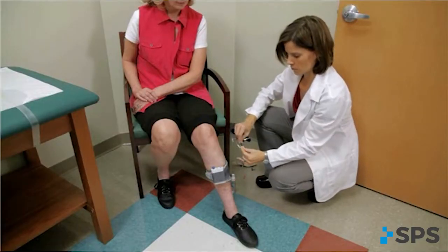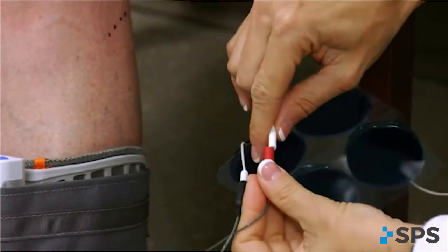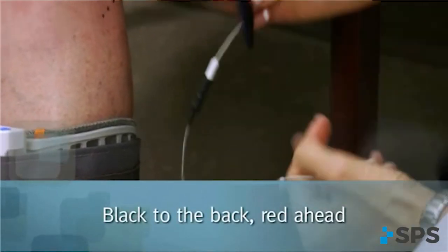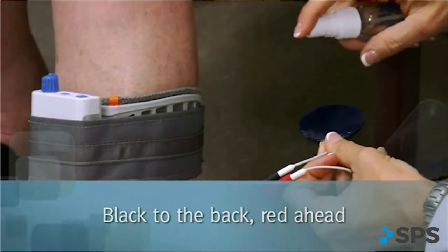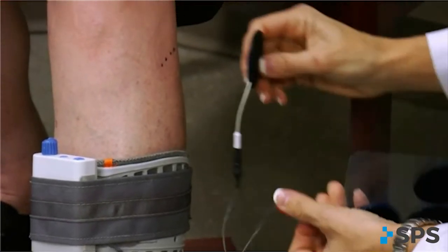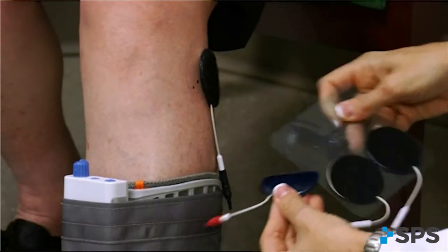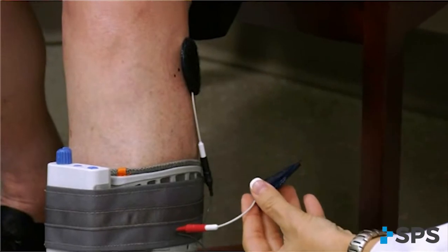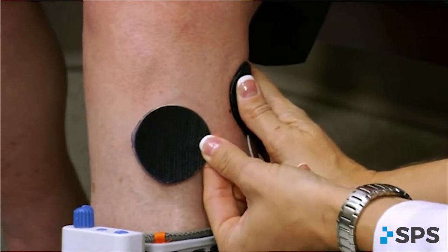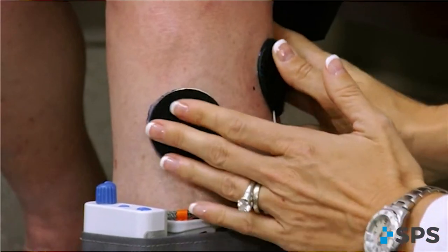Connect the electrodes to the walk aid electrode lead wires. Make sure the black lead, negative, is connected to the back electrode and the red lead, positive, is connected to the front electrode — black to the back, red ahead. Moisten the electrodes with water. Place the back electrode connected to the black lead wire over the mark identified during the mini stim testing procedure. This is the active electrode that will stimulate the motor point of the nerve. Position the front electrode connected to the red lead wire on the upper third of the tibialis anterior muscle belly. This is the inactive electrode that pulls the stimulation back out of the body to complete the circuit.